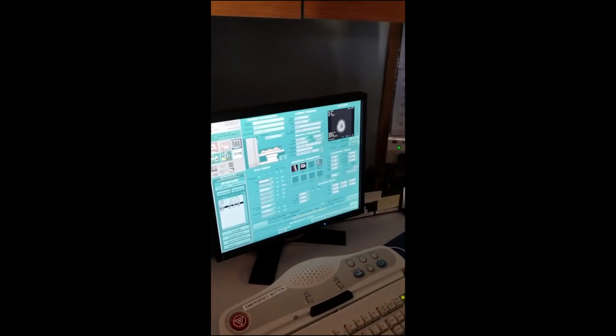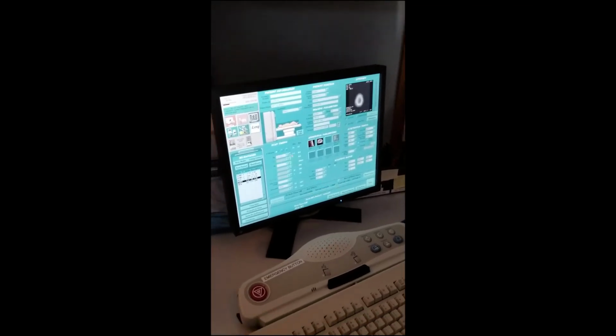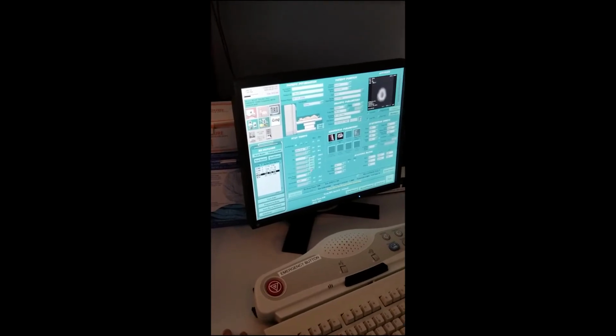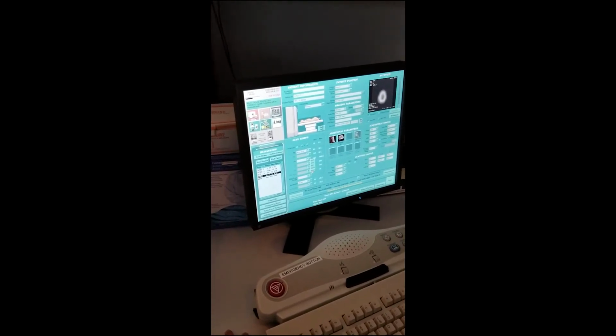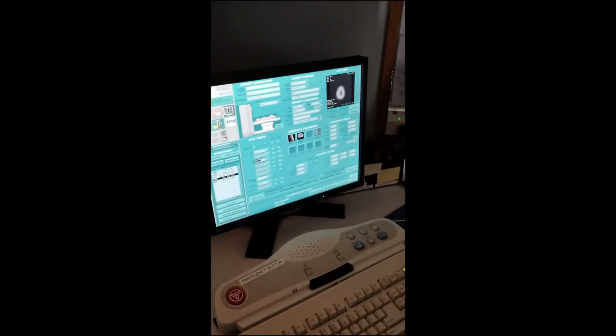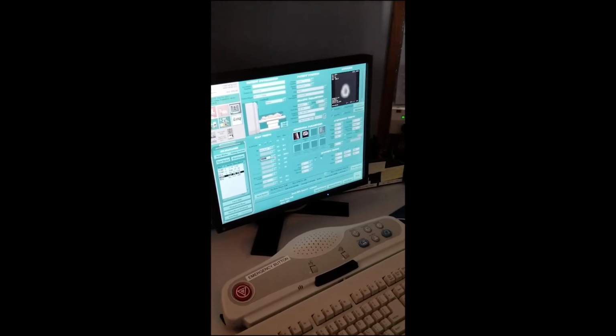Okay. So TE is going to be short, minimum. And TR is going to be long, so we're going to go with 4,000? Well, try. How many slices is it giving you? 51. Do I need 51? How many do I need? Let's try 2,500. Are you okay, Eric?